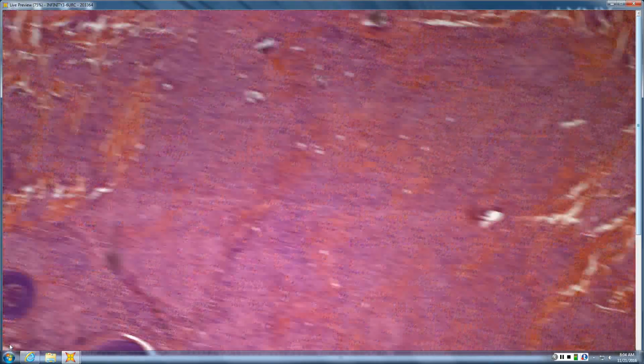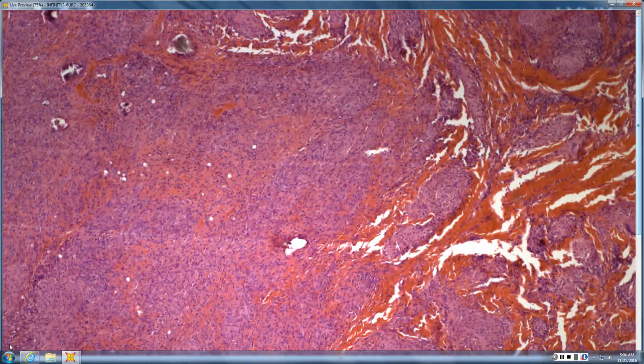Granuloma. Well, you might even have scar sarcoid in a different slide where you would get some foreign debris. The key clinically would be to distinguish a straight foreign body granuloma, which tends to be lots of foreign body giant cells, from one that's basically a naked epithelioid granuloma with some giant cells. That's more likely to be sarcoidosis clinically. The key would be that this patient deserves a workup for sarcoidosis, with or without any foreign body nidus around which the granuloma formed.